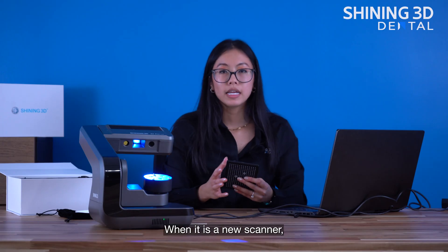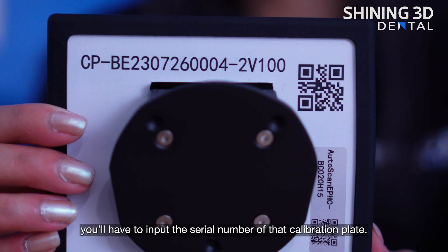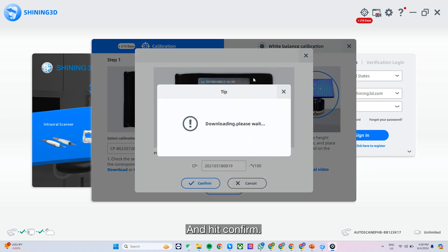When it is a new scanner, you'll have to input the serial number of that calibration plate. So we'll click download and hit confirm.